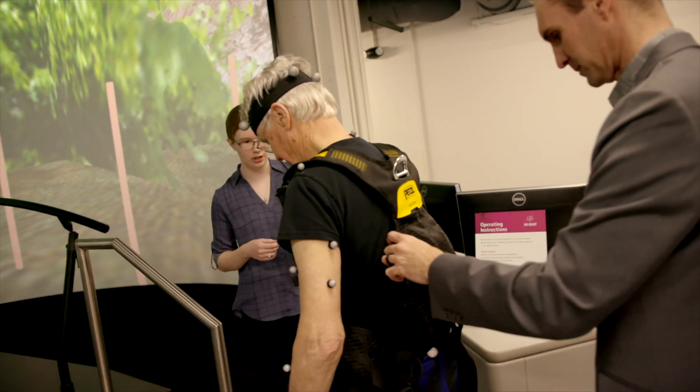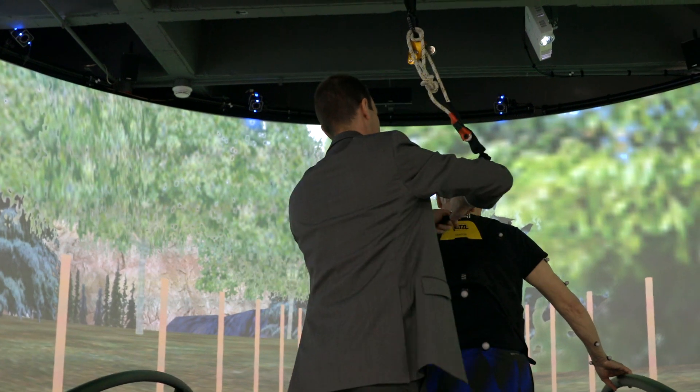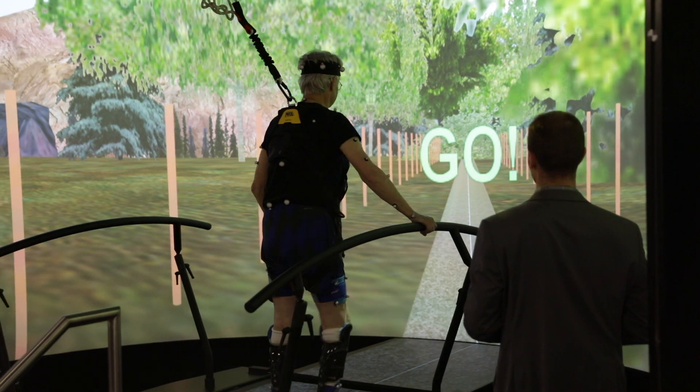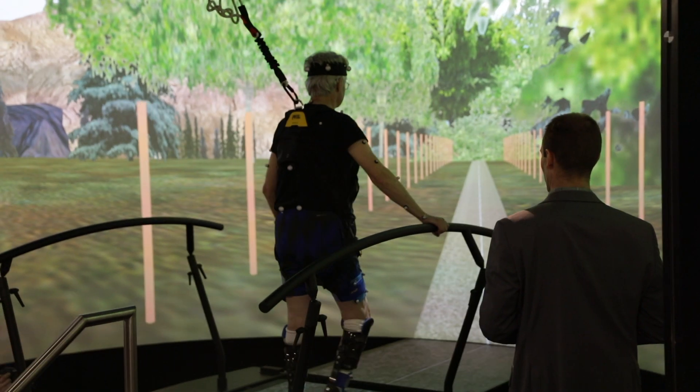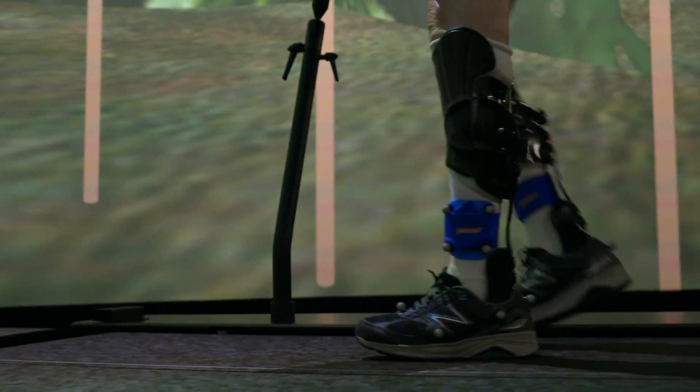I met Jason almost two years ago, early April of 2018. He showed me a number of videos of individuals in similar circumstances as mine who before had a lot of difficulty walking, but then when they wore these devices, they could walk much better and even in some cases run or jump.